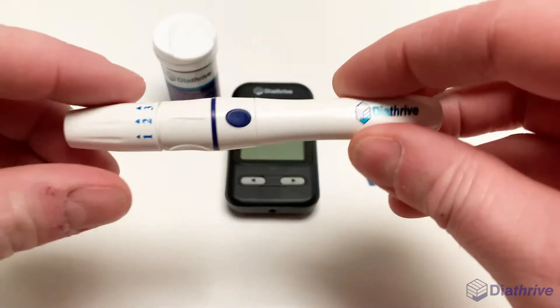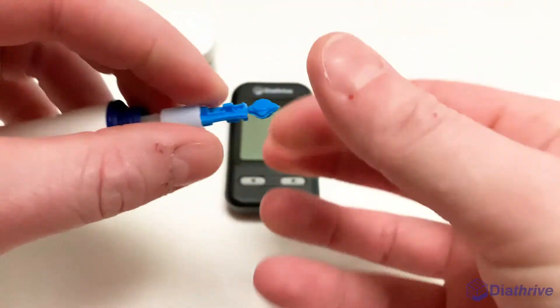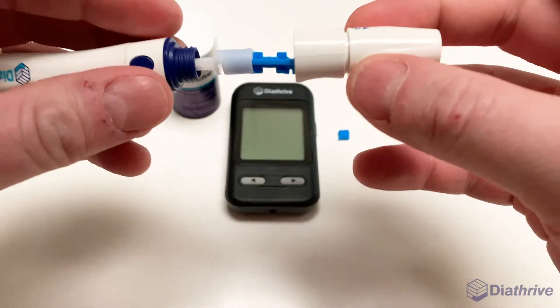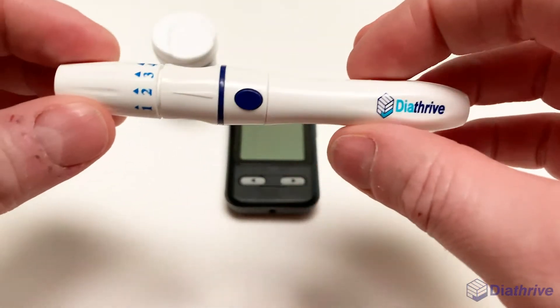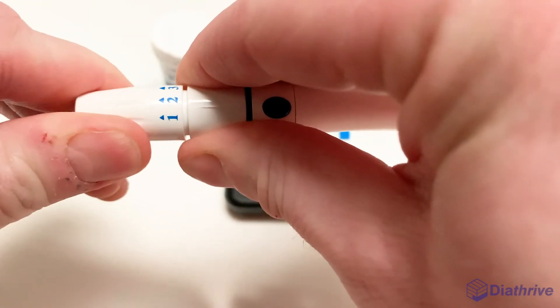Step 2: Prepare your lancet. Unscrew the cap of your lancing device and insert the lancet. Carefully twist the end of the lancet and pull straight off to avoid bending the metal. Screw the cap back on. You can adjust the lancing depth by twisting the end of the cap, lining up the arrow with a number. The higher the number, the deeper the lancet will go into your skin.